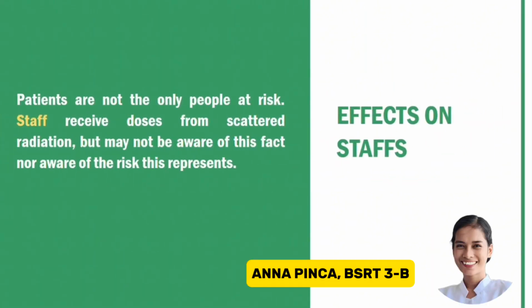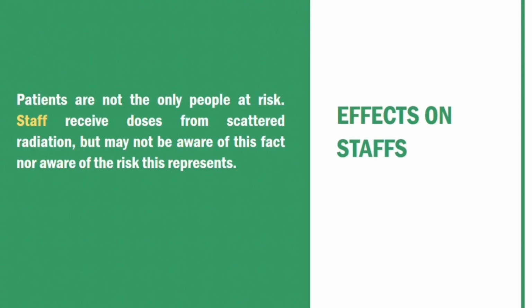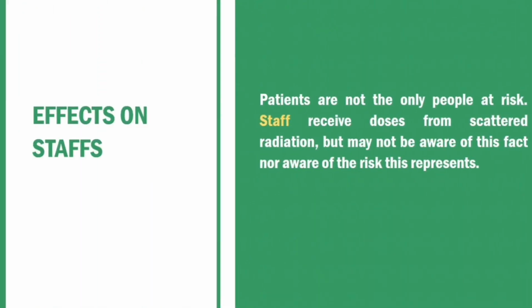Effect on staff. Patients are not the only people at risk. Staff receive doses from scattered radiation, but may not be aware of this fact, nor aware of the risk this represents. Before the late 1960s, attempts at interventional radiology had been curtailed, mainly because of the radiation hazards involved, primarily to those performing the fluoroscopy.